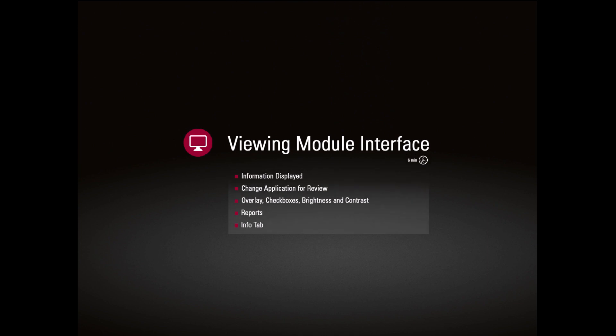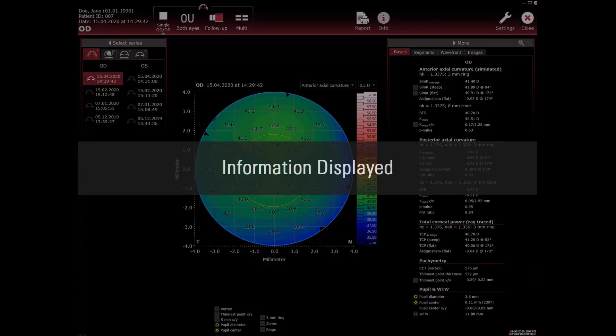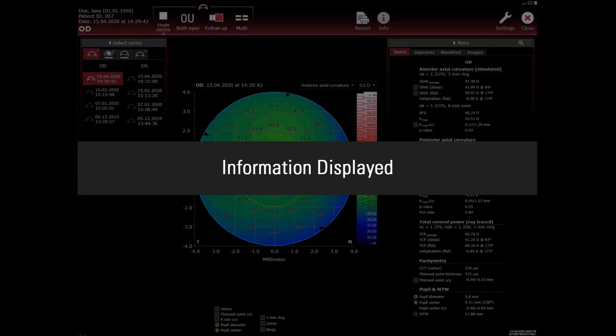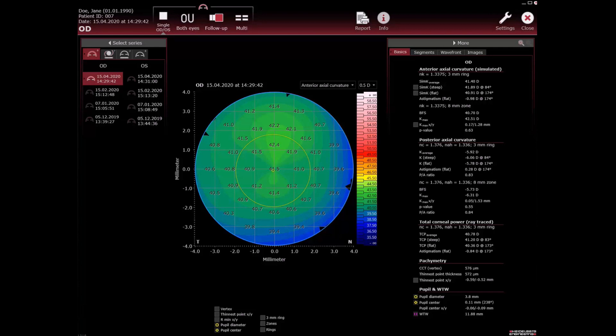Viewing module interface. In the viewing module the following information is displayed.